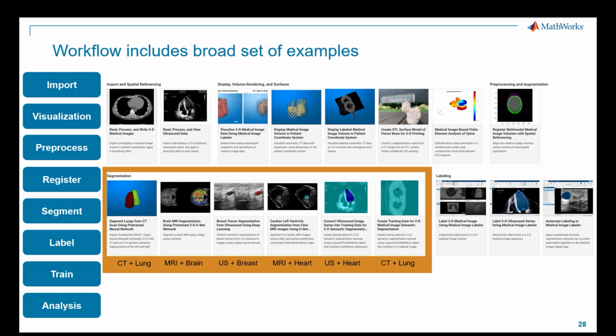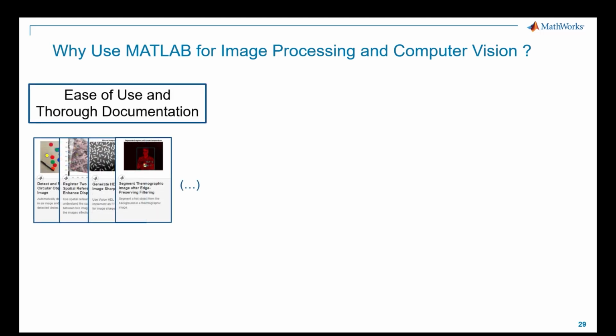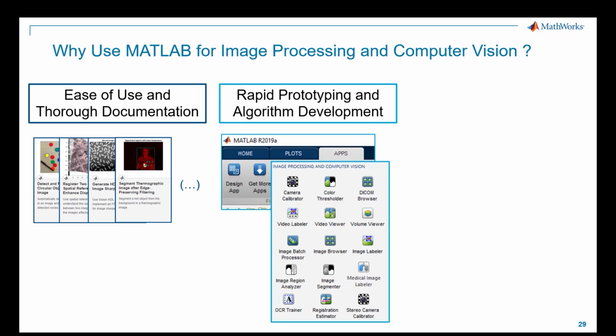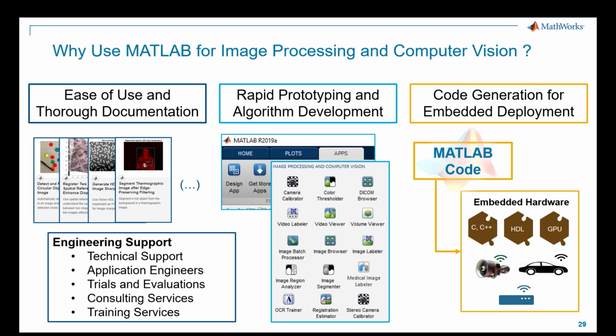I'm going to wrap up by steering you to a long list of relevant in-doc examples, which you should be able to try out pretty easily. So in conclusion, MATLAB supports your medical image processing tasks with great documentation and examples, with environments that facilitate rapid algorithm development, and with code generation and validation tools for deployment to your user base. And we're here to help with tech support, application engineers that you can call on, and free trials and evaluations. And if you need deeper dive assistance, we have training and consulting services to help you.